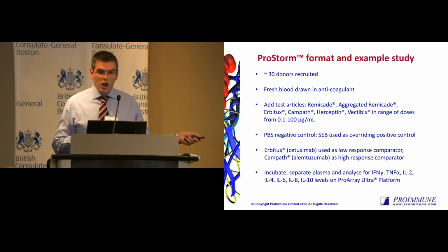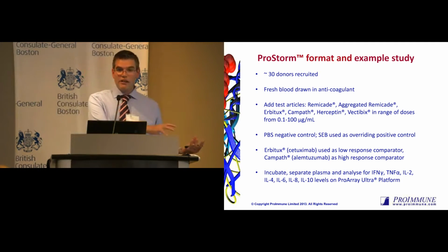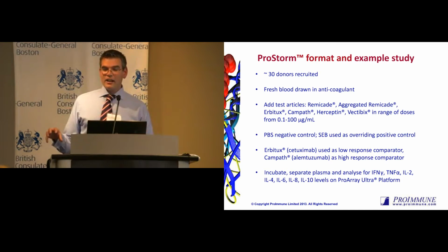We also include a low response comparator and a high response drug comparator, and then we're able to incubate those molecules in a very short assay time. So literally you're taking fresh blood from fresh donors, adding the drugs into culture pretty much within a matter of minutes, and then going on and doing the analysis.